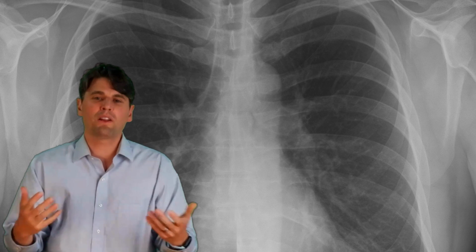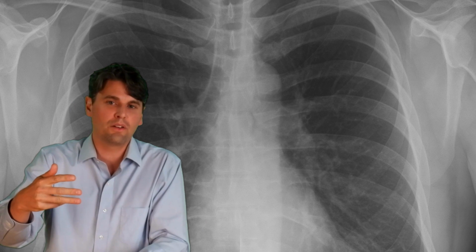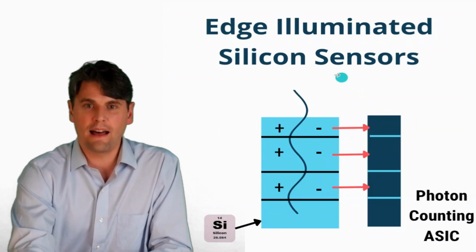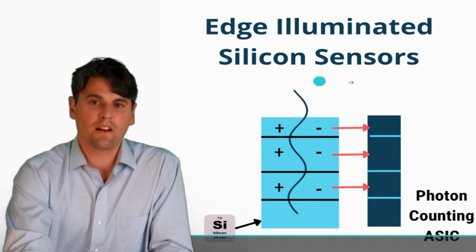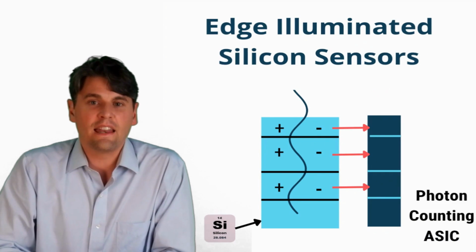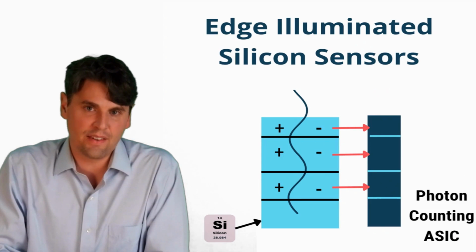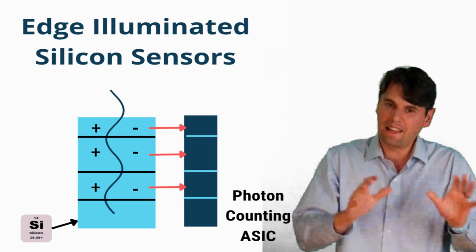Danielson had the idea, what if you take one of those silicon-based detectors and instead of using it like they normally do in a high energy experiment, let's turn it on its side so that most of the energy will be able to be deposited because now we'll have a long path length of silicon. So this is another possible way that you can do photon counting in CT. In this type of scenario, the X-ray comes through and can deposit its energy at different depths in the silicon. In that manner, you can allow for significantly higher count rates without getting into the region of significant pulse pileup.